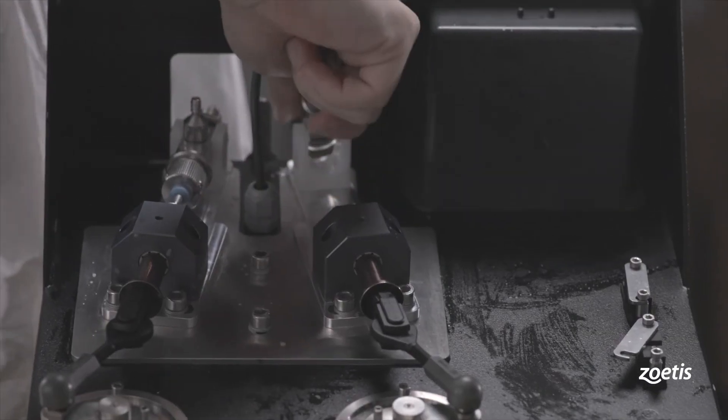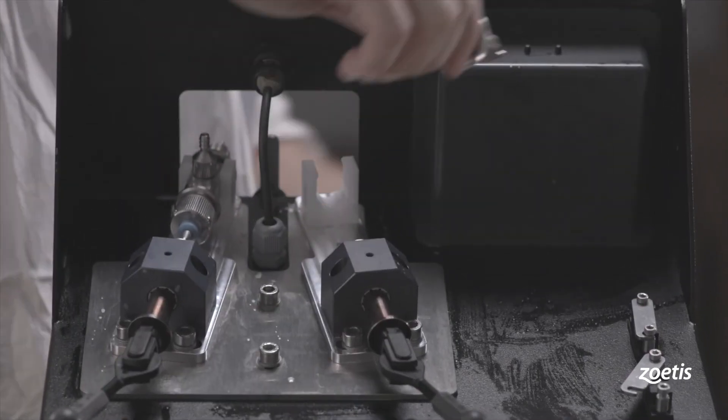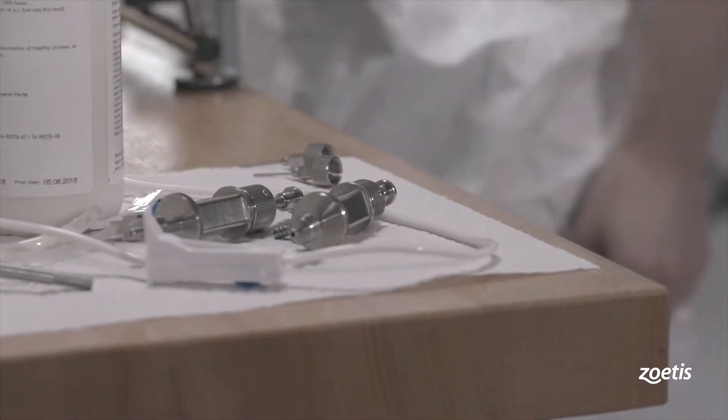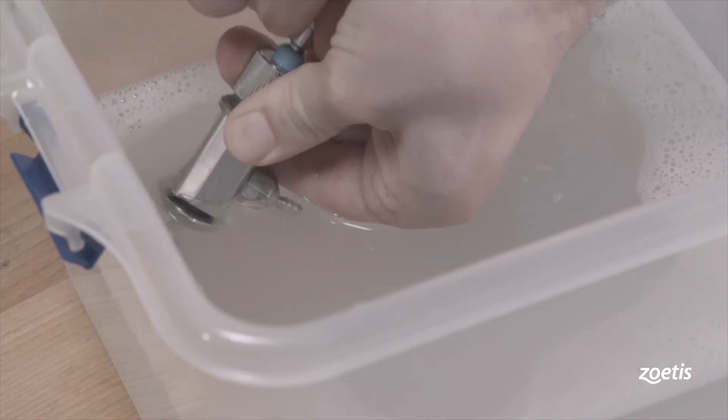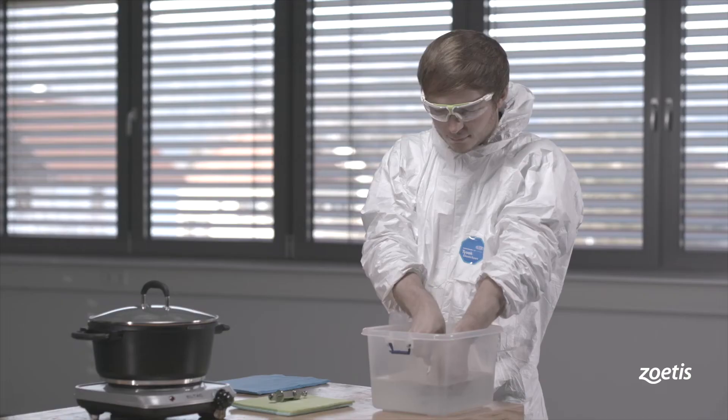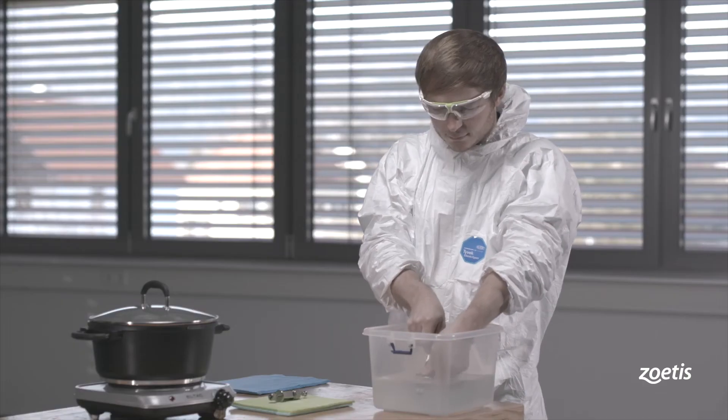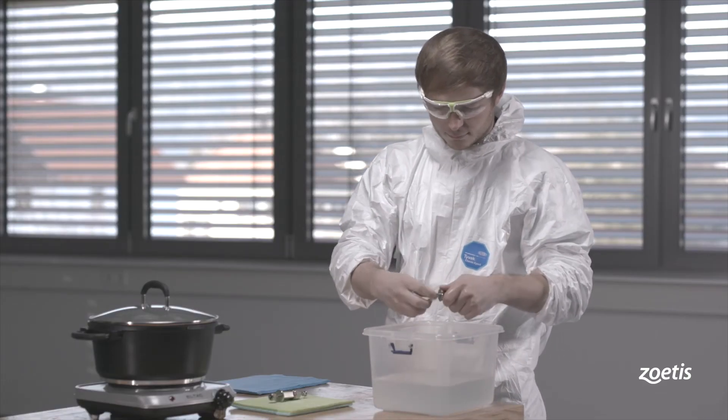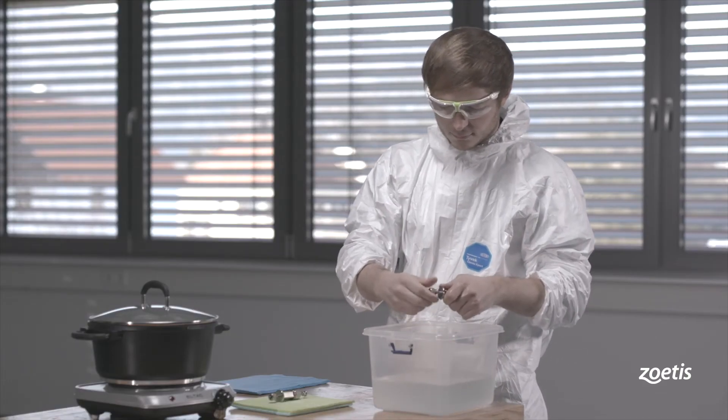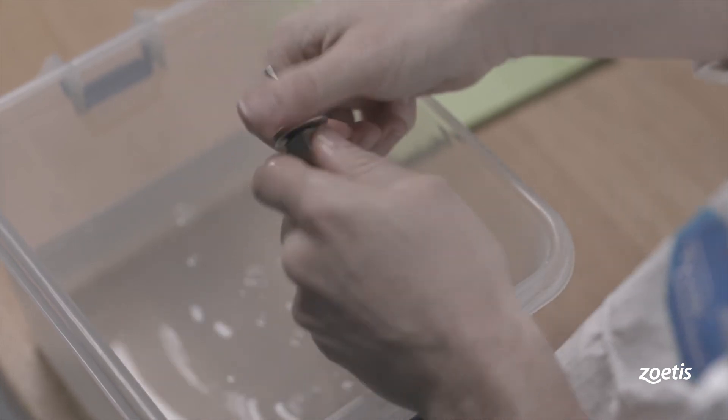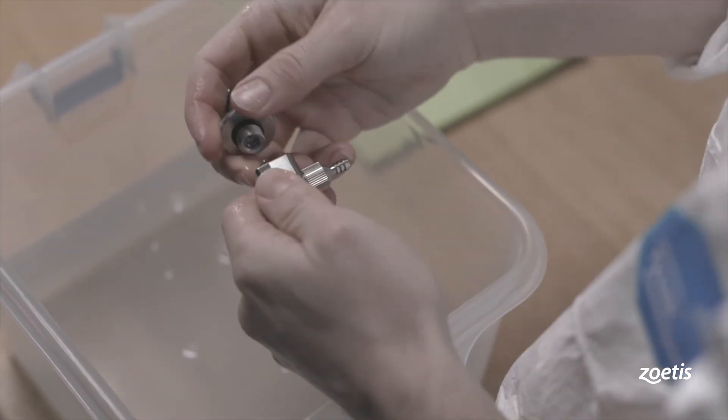Separate the syringes from the device. Flush the syringes with warm water to wash away all contaminants. Disassemble the device step by step as shown.